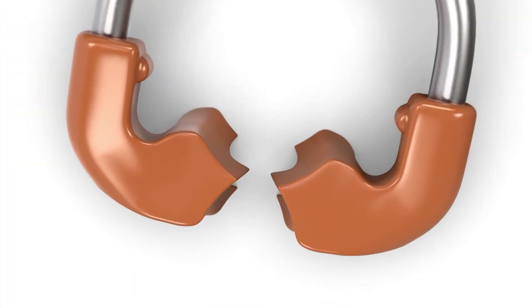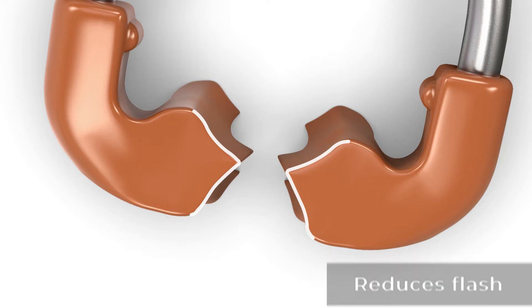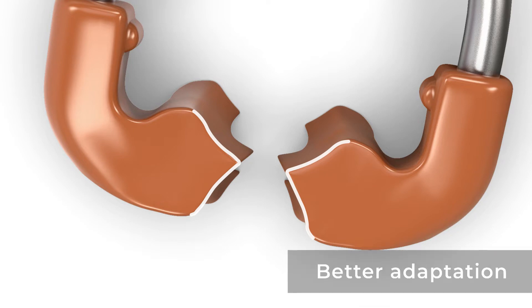The ring has some beaks designed, and this beak helps in adapting the matrix even better. Clinically speaking, that means there is less flash — I don't need to remove as much flash from the buccal and lingual. So it helps a lot in adapting the matrix better on the buccal-to-lingual aspect of the tooth.